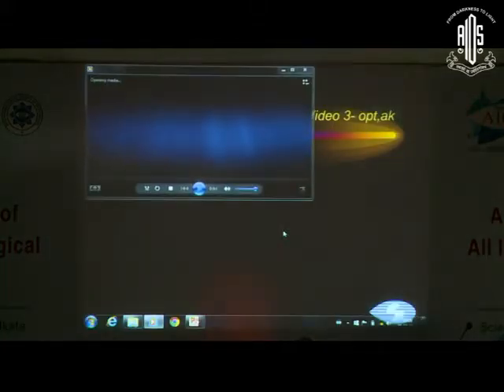And this is the last video now. This is showing a combined retinal detachment. You see the retinal break here. It's important again to separate the hyaloid peripheral to that, to be able to remove the entire fibrovascular tissue. There must be no residual traction left on that break when you've completed the case.